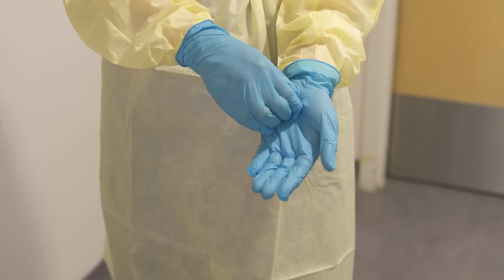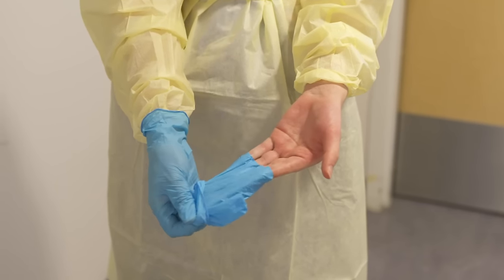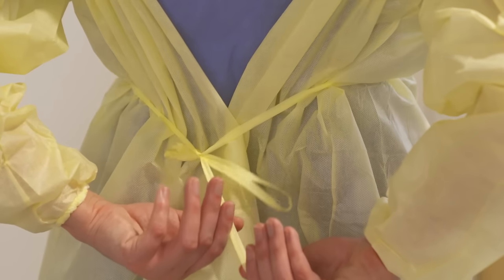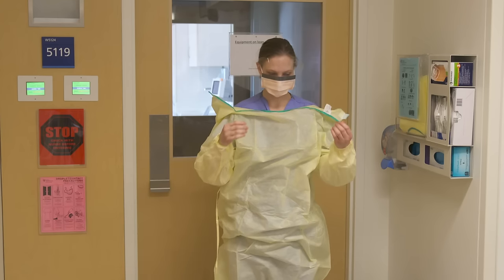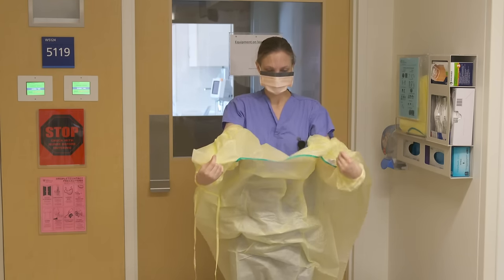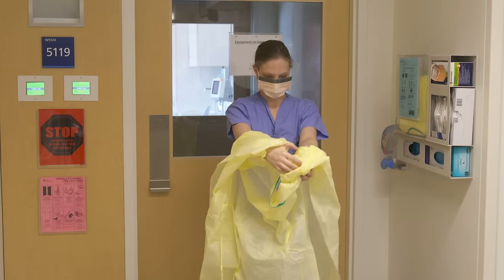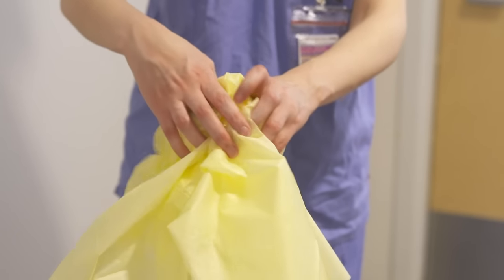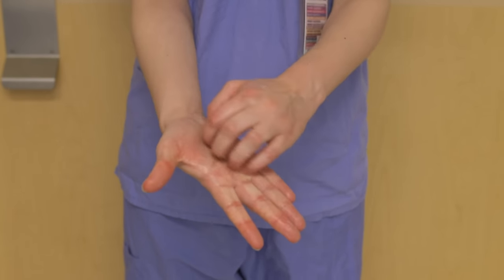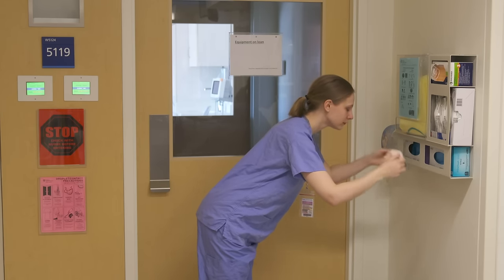Follow the same doffing procedures by removing gloves one at a time using the glove-to-glove, skin-to-skin technique. Remove your gown by opening at the neck and then the waist. From the back of the neck, take the gown and slowly pull it out and away from you, touching only the inside as you roll it into a ball and place into the garbage. Perform hand hygiene. When doffing a procedure mask, carefully remove straps from ears and pull forward and away from your face and body. Perform hand hygiene again.